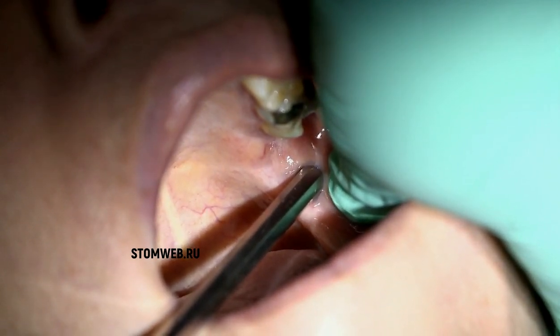The height is determined by the coronoid notch, the deepest point of the raphe, and is usually placed about 10 millimeters above the occlusal plane.